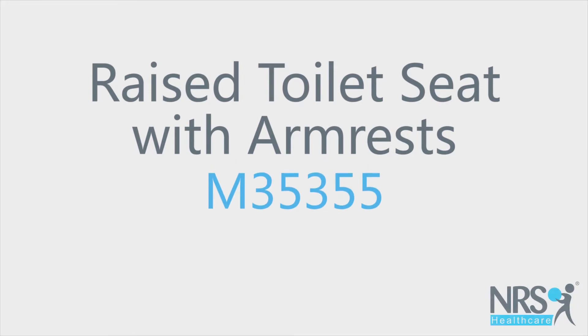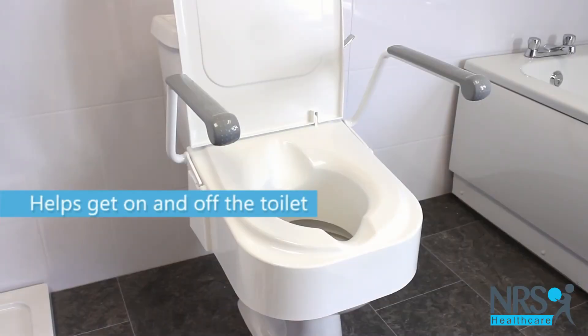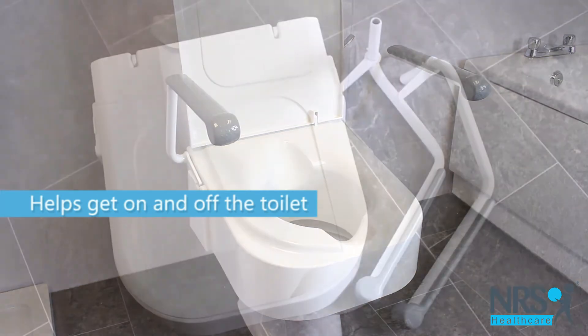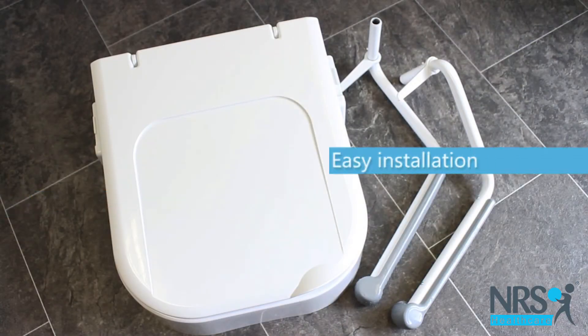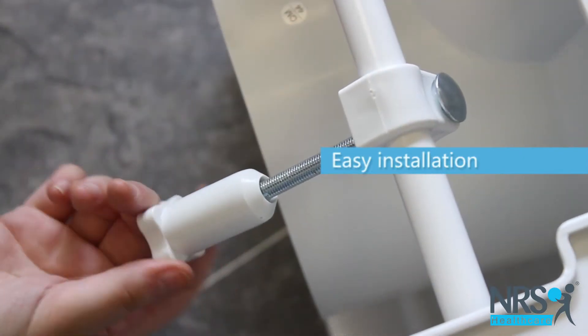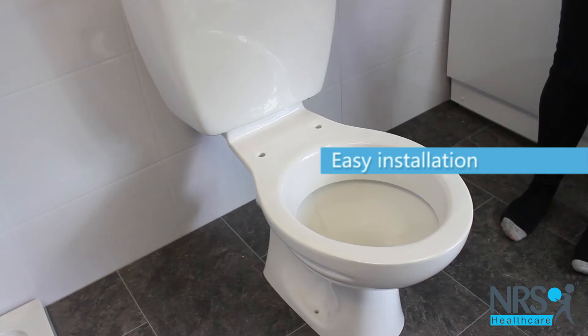Raised toilet seat with armrests. This toilet seat can help if a standard toilet is too low to sit down onto and rise up from comfortably. It's easy to install in place of a standard toilet seat and comes in a choice of three heights.